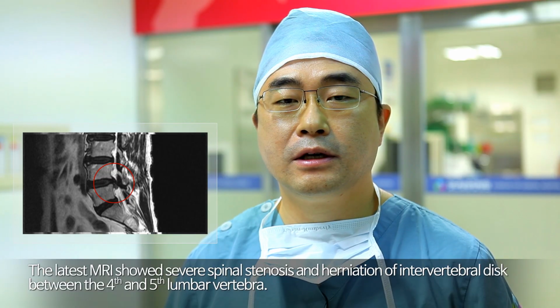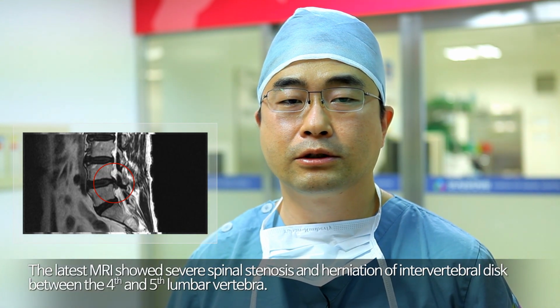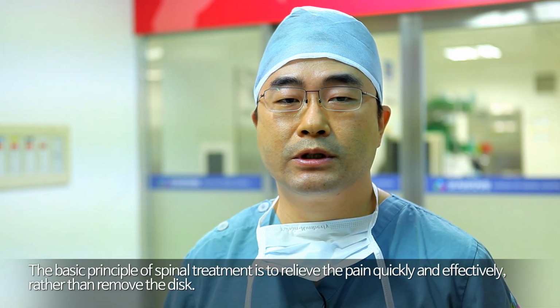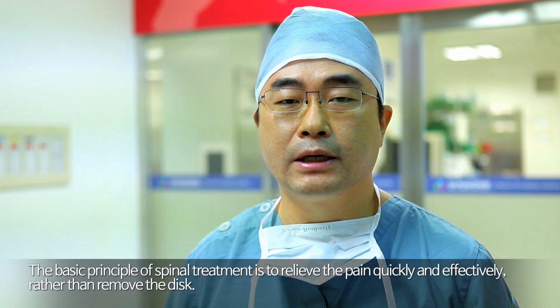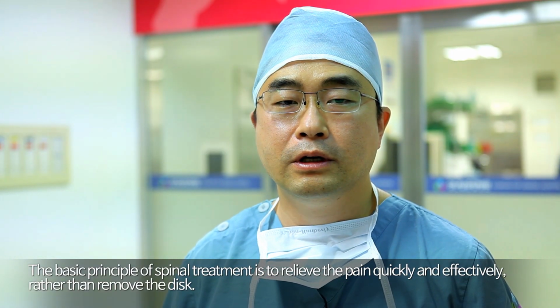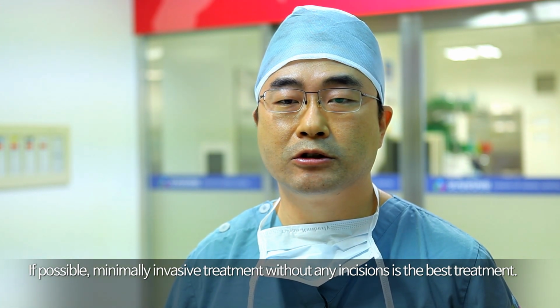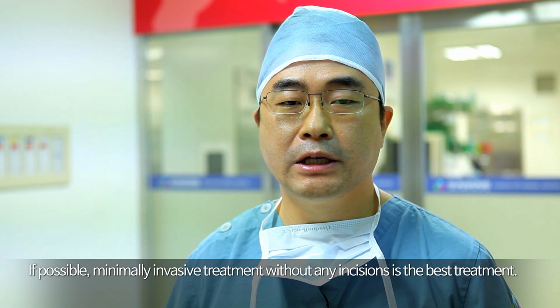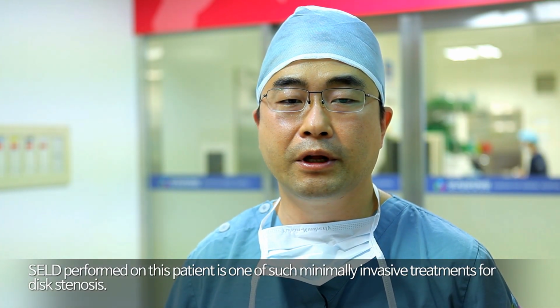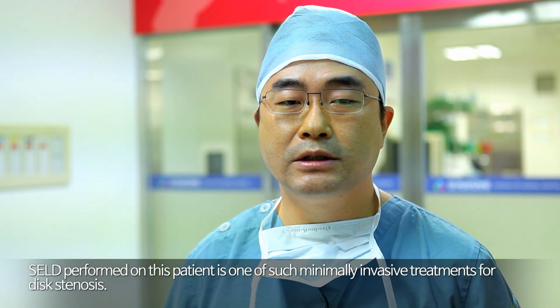The latest MRI showed severe spinal stenosis and herniation of intervertebral disc between the 4th and 5th lumbar vertebra. The basic principle of spinal treatment is to relieve the pain quickly and effectively, rather than remove the disc. If possible, minimally invasive treatment without any incisions is the best treatment. SELD performed on this patient is one of such minimally invasive treatments for disc stenosis.